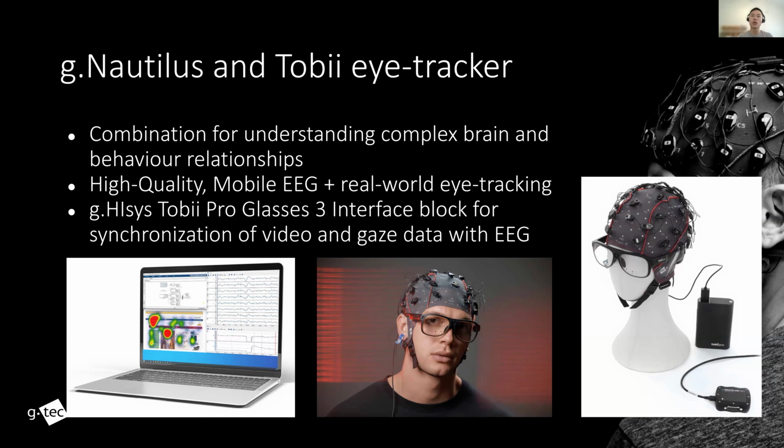This also allows you to enhance real-life BCI application because the eye tracking data can help you to pinpoint the target location, just like this image. You know where they are gazing at and what interests them. At the same time, the EEG data from the Nautilus device itself can verify the mental status and improve the BCI response.